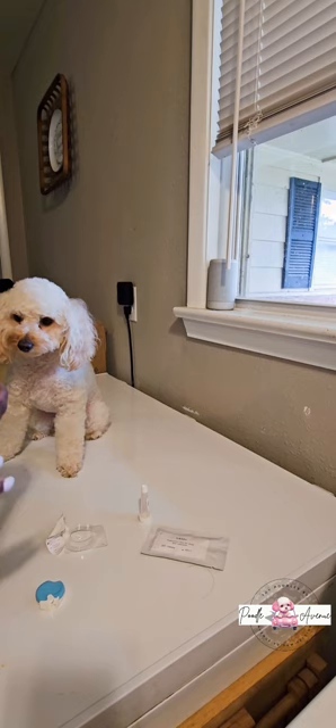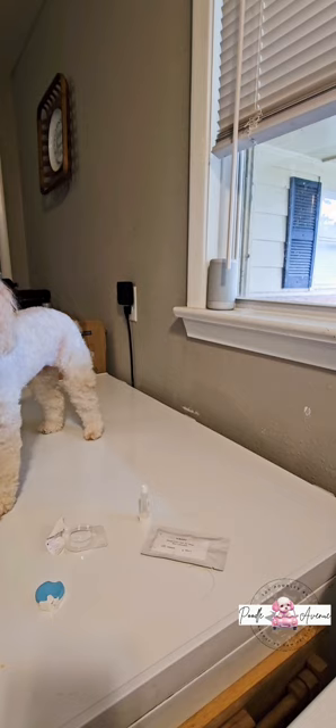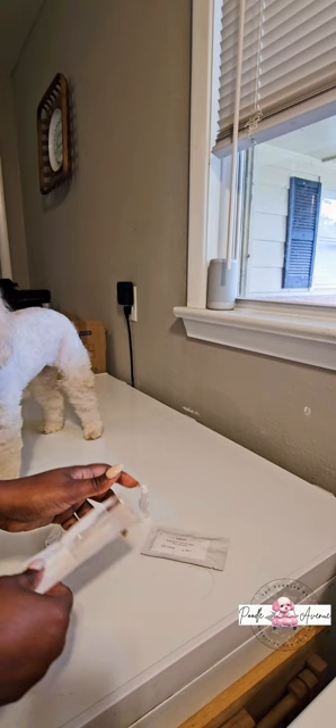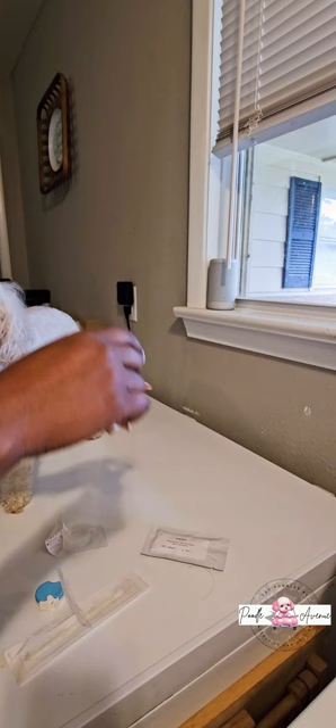See Mom, I'm not gonna hurt you. Let me get my test swab together so I won't be fumbling with that. This is the swab — oh baby, I'm handicapped with nails, hold on a second. Okay, there we go. It says to open the top of this and swab it around about five times inside the fluid, then let it sit for a minute.